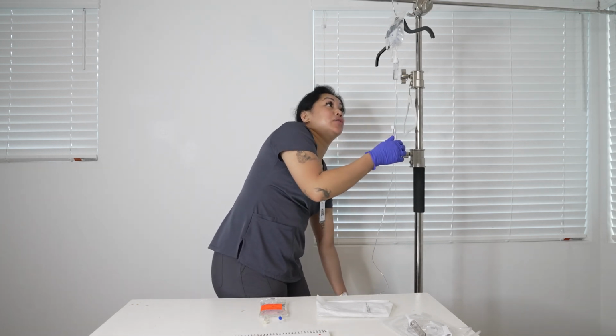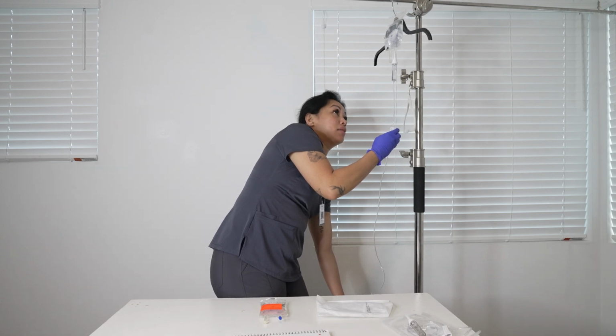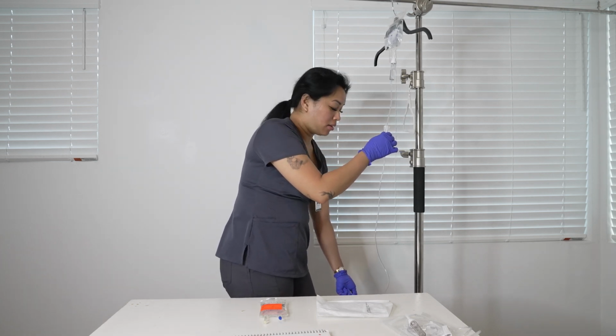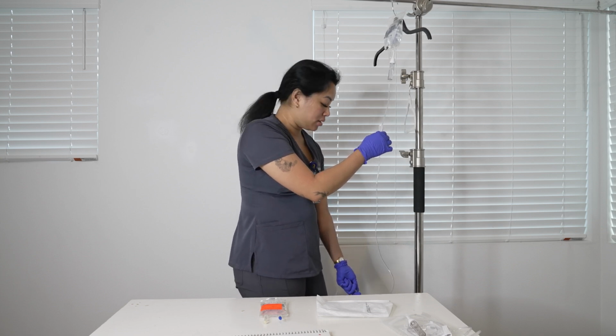And we have to make sure that the fluids is 30 inches above the patient's IV site.